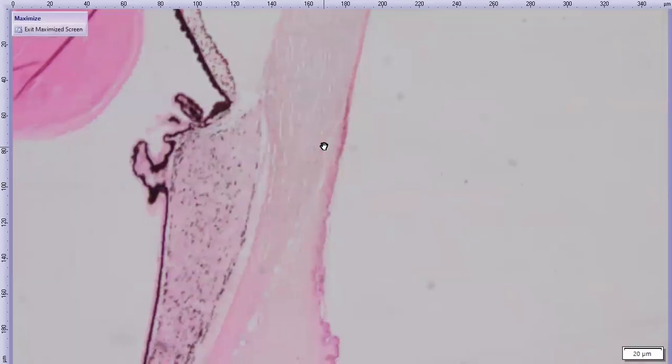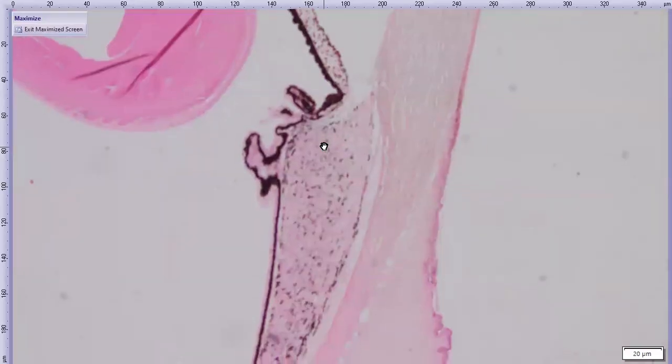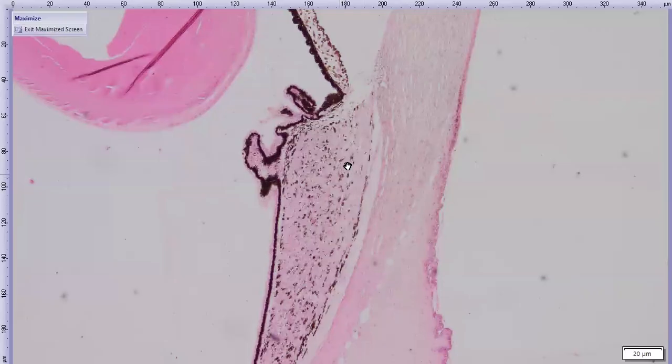So this is a primate. Here's the ciliary body. And all of this pink area here is the ciliary muscle. I've already showed you the ciliary muscle from the bird, and you'd say, oh, well, this is much bigger than the ciliary muscle in the bird. But remember, this is a smooth muscle, and the other one was skeletal muscle. So how does this muscle work?